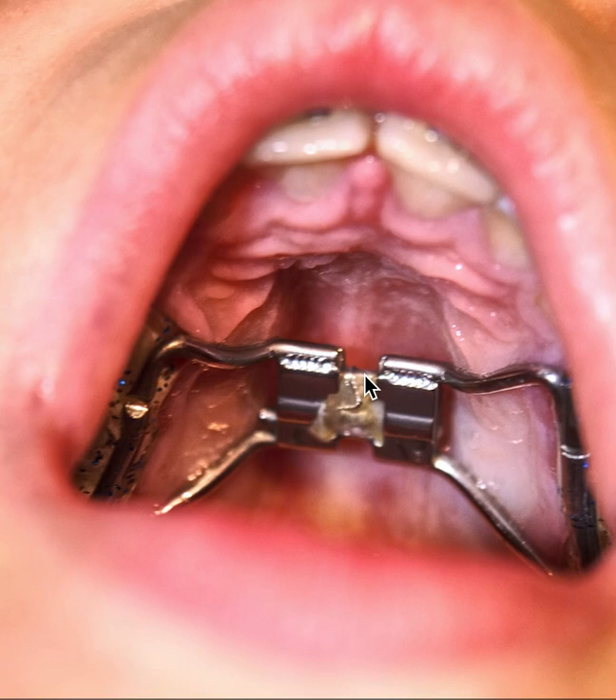Sometimes adults get these, but usually these go to kids who are still growing. Once the child is completely skeletally mature — meaning their bones are mature, they're not growing height-wise or jaw-wise anymore — this can happen anytime between the ages of eight and 17, depending on if they're a boy or a girl. Once they're skeletally mature, generally it doesn't tend to work.